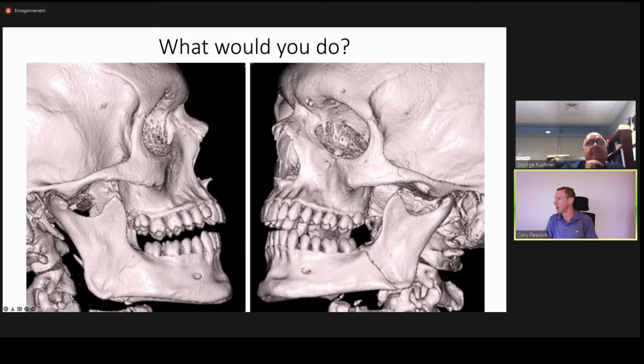There's not a great way to know where all those tooth roots are going to be in some scenarios, except for using the tools that are available, which are the radiographs we already have. You can look at your radiograph and see if there's some abnormal root anatomy. You can see if the roots around, say, the premolar teeth where you might be putting that IMF screw diverge or converge. If you can see that those roots really converge on your radiograph, you might not put an IMF screw there or just choose a different technique.